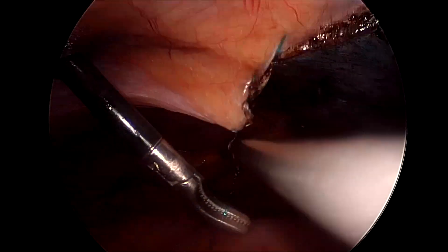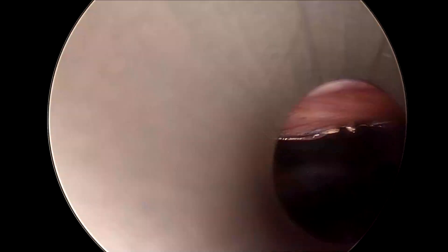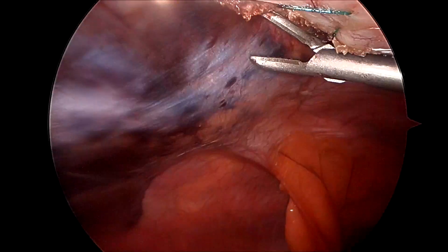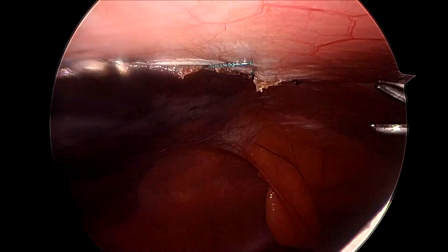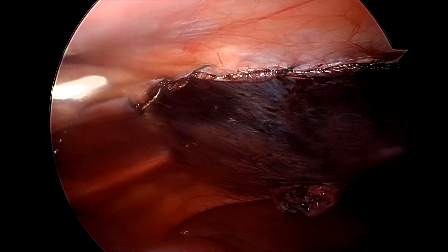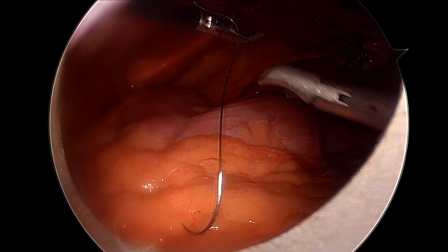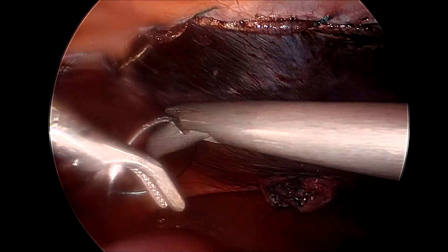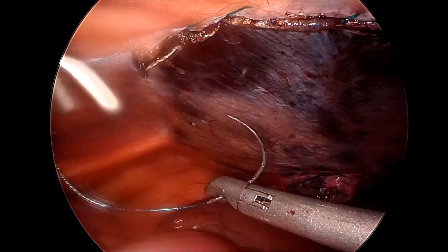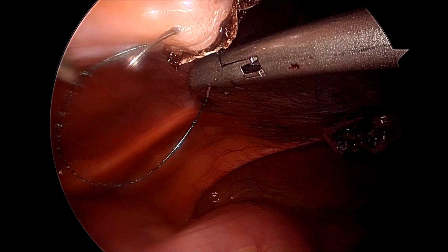Once we have closed the flap completely, we take a look back at the flap to ensure there is no gaping. Then we take a couple of bites backwards before cutting the suture flush to the peritoneum.